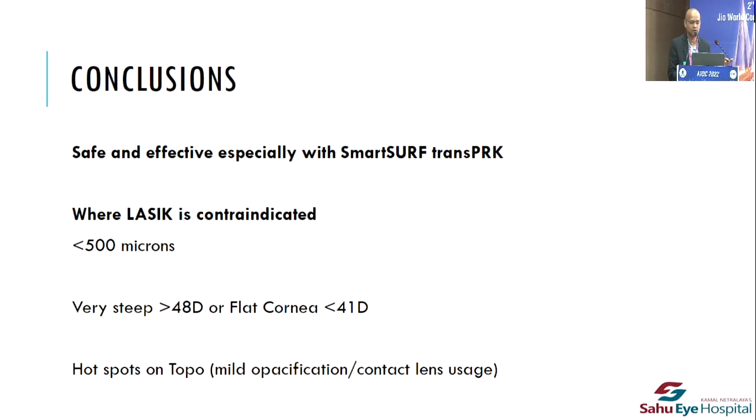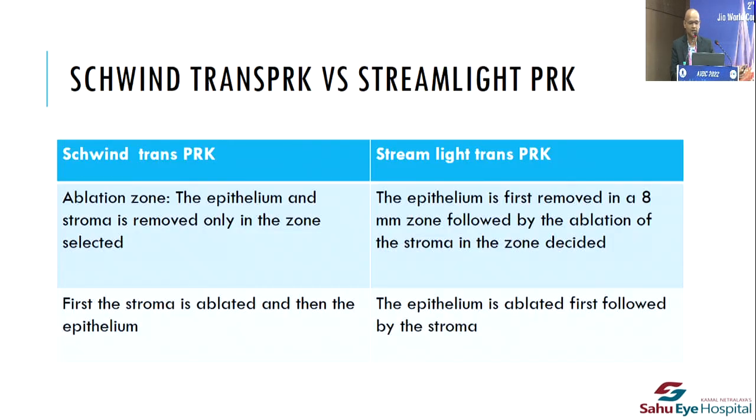So I would like to conclude by saying that it's an extremely safe and effective procedure. I do it where LASIK is clearly contraindicated: steep corneas, flat corneas, when you see hot spots on topography where you're scared that if the keratome goes through, you might have flap complications.